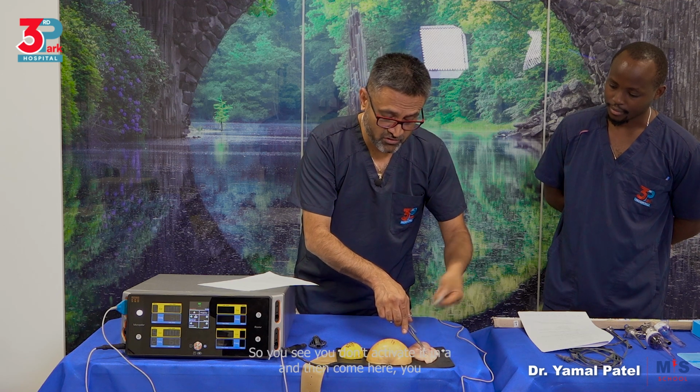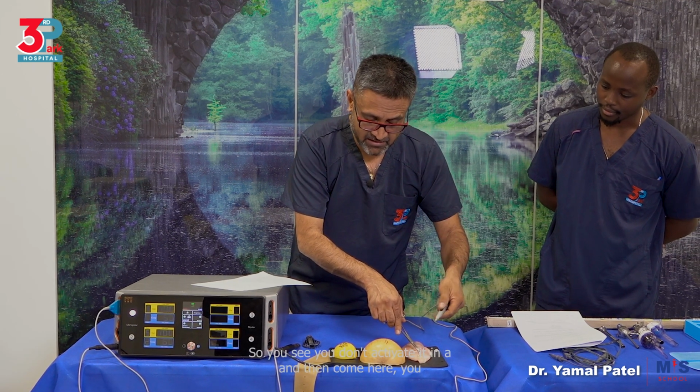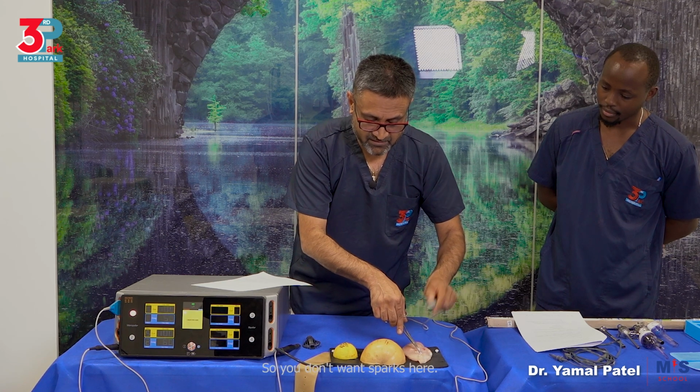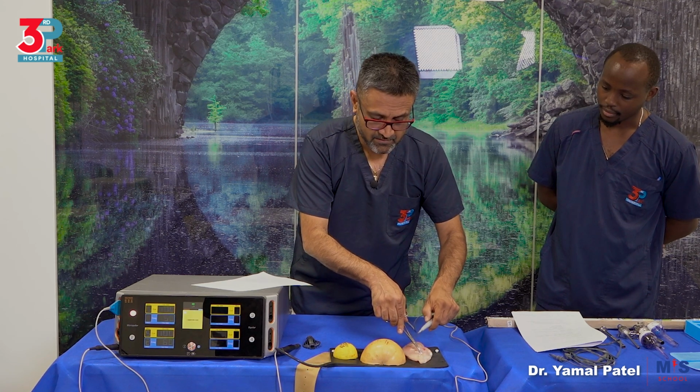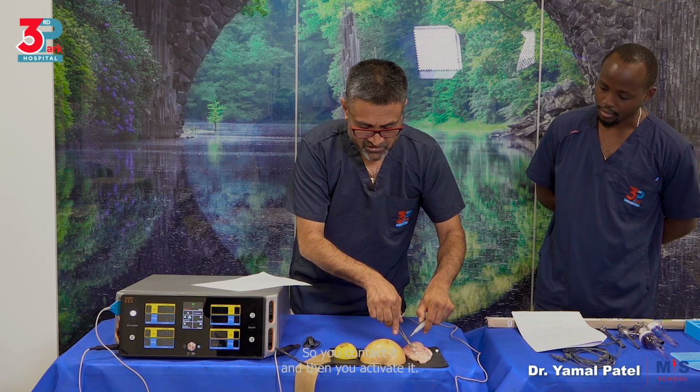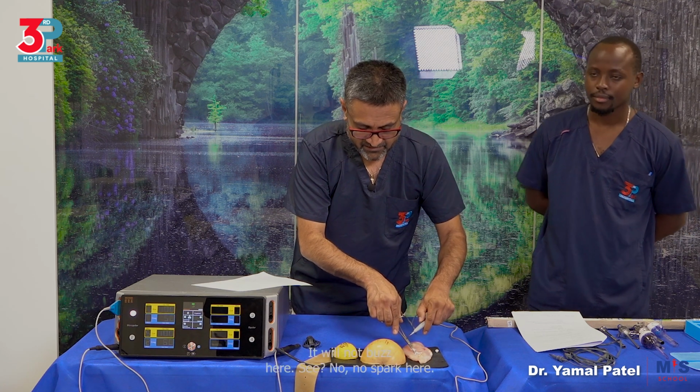So you see, you don't activate it in air and then come here. You will see sparks, see? So you don't want sparks here. See that spark? You don't want that spark. So you contact it and then you activate it. It will buzz there, it will not buzz here.